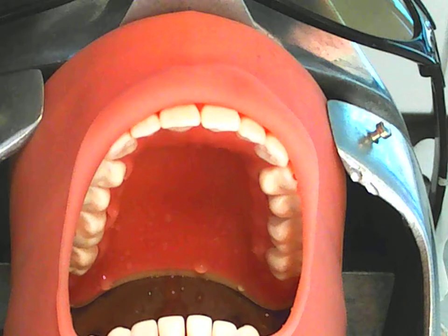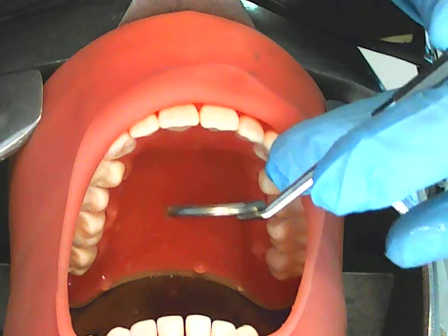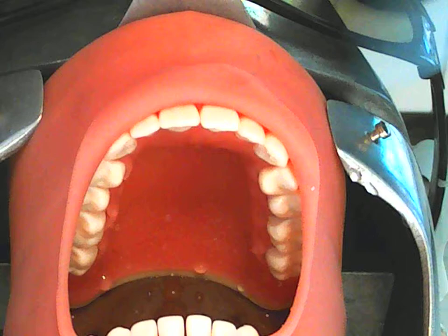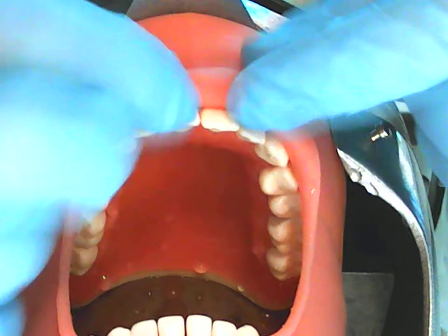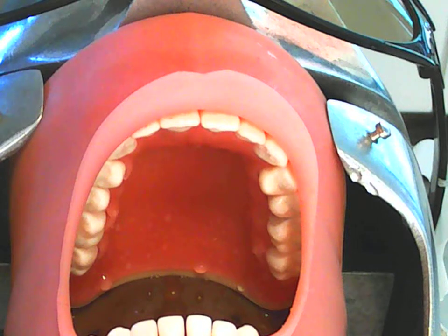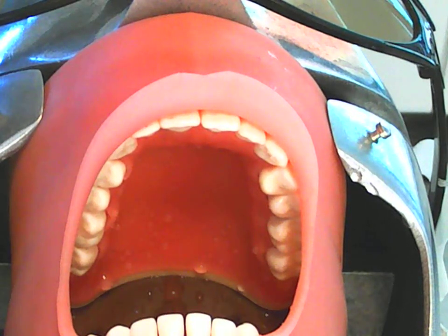So we'll also ensure that there's no missing pieces by checking the oral cavity. And it looks good. There's no dental dam pieces in there. Okay. If there was, you could remove them with a piece of floss, a cotton pliers, or explorer. How are you feeling? Feeling okay? That's fantastic. And that concludes the demonstration of the application and removal of dental dam for a single anterior tooth.